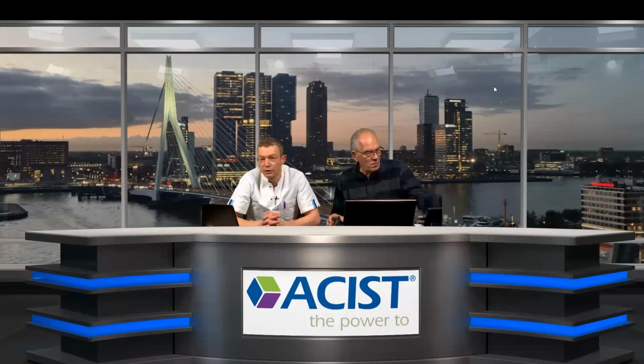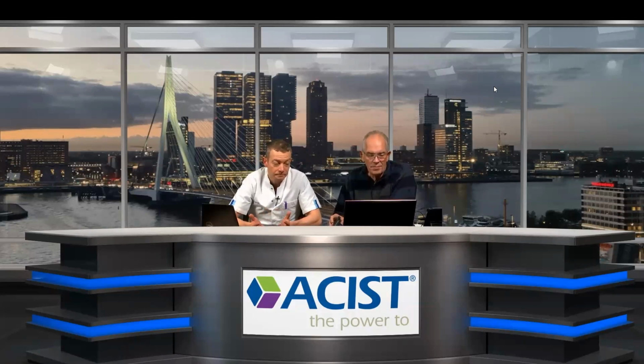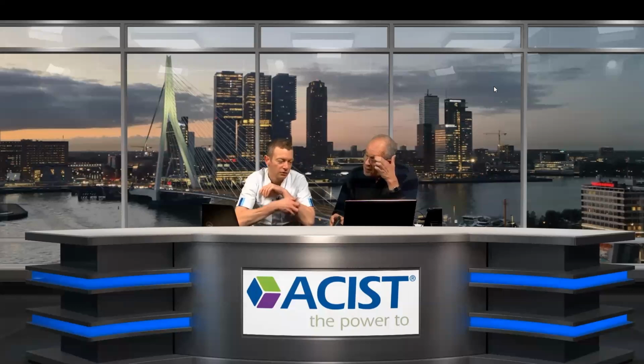And there's not much else to do than pray that this calcific nodule is at least partly modified. And I think you should always consider that we're simply not able to take these calcific nodules out. The only time they go out is if you perforate, and that's exactly what you don't want. So I think this is the best we could do at this stage.